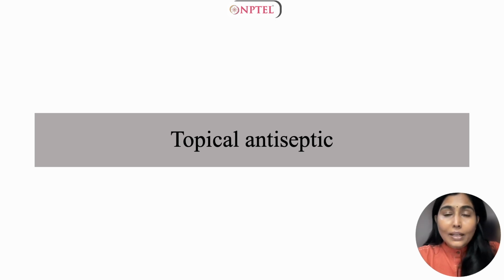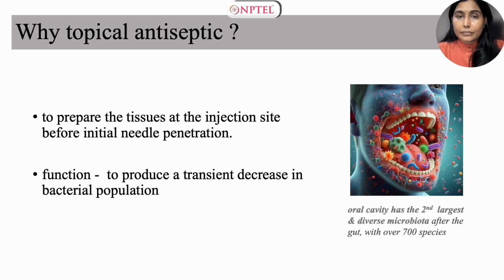To begin with, the topical antiseptic. This would be the first step to consider before any injection. Unfortunately, it is not followed by many. It is a common practice to disinfect skin before any hypodermic injection to avoid introduction of microbes into deeper planes through a needle. Similarly, oral cavity also deserves the same because this is more fulminant with microbes. So it is definitely a good practice to start with a topical antiseptic.